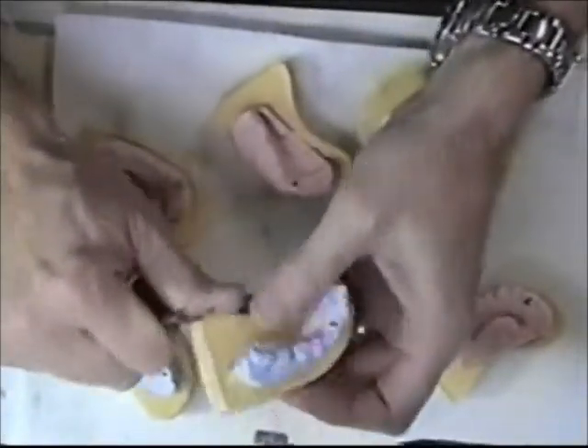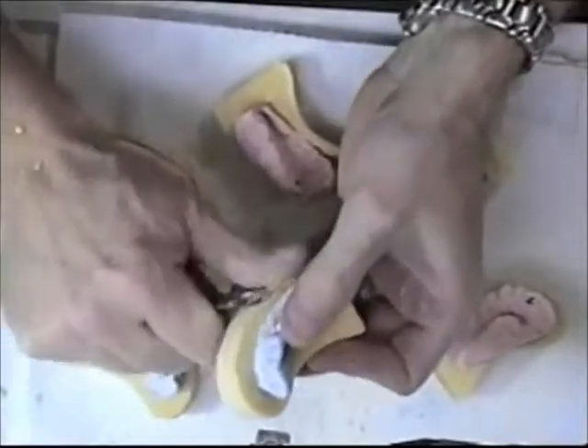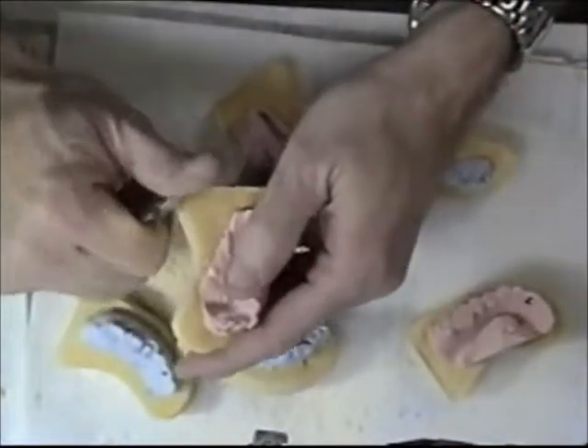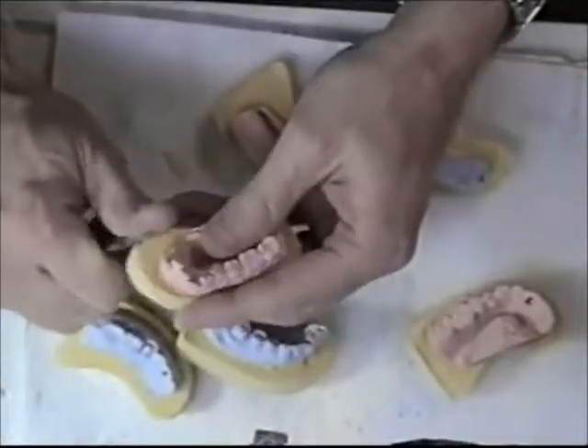You're going to want to be handling these models while you're making your crown and other steps, and you're not going to want any sharp edges. Plus, it will look nice and presentable to the doctor.